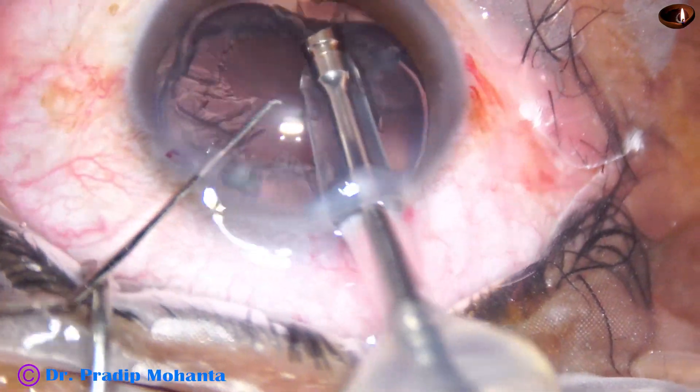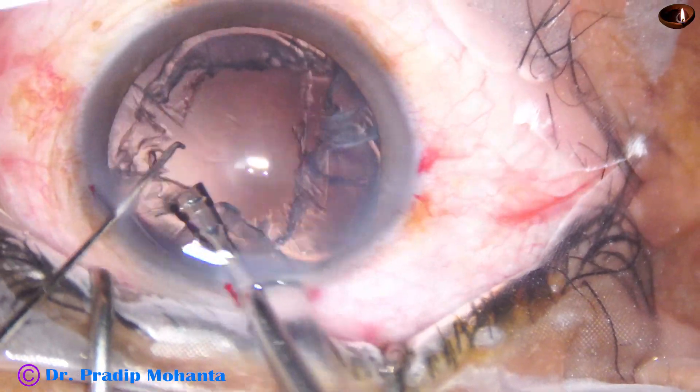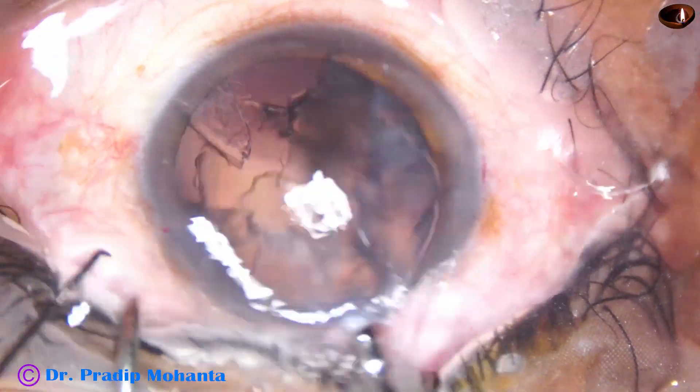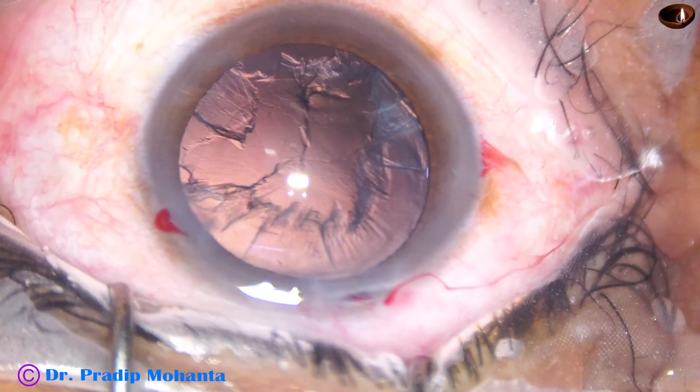So in less than two minutes, so many steps are done. Very expert, very efficient, very competent surgeon.